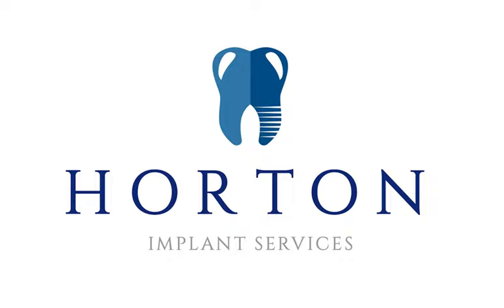The intraoral scan is usually taken, if not, it's been taken already, which is the equivalent of the impressions for study cast diagnostic needs. So that can get sent to the lab and a diagnostic work through can be made, understanding where, because we always work from a prosthetic way to place the implant. So in other words, we look at what's going to be placed on the patient in terms of a tooth, a bridge, full arch bridge, or dentures, and then that guides where the implants are going to go. And that's the way the workflow always works. So that's the need for the digital scan or the impressions.